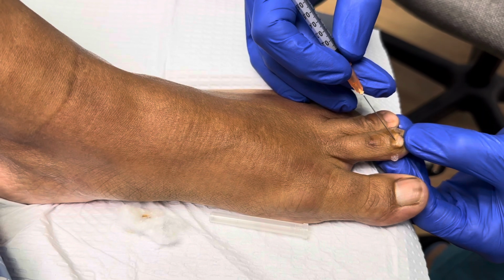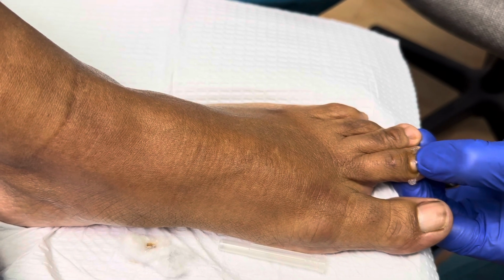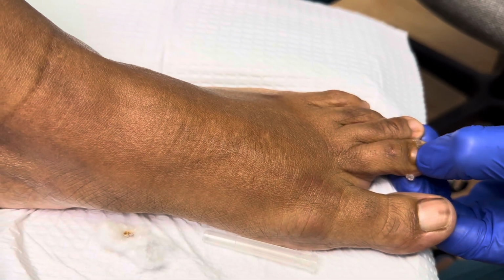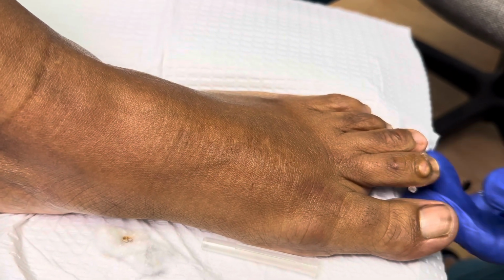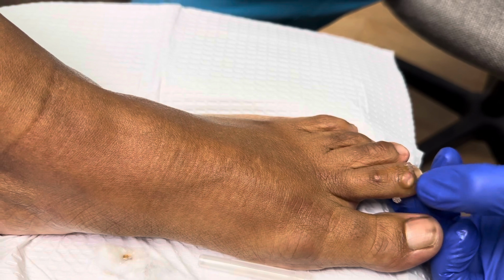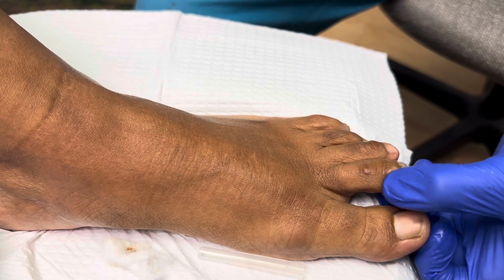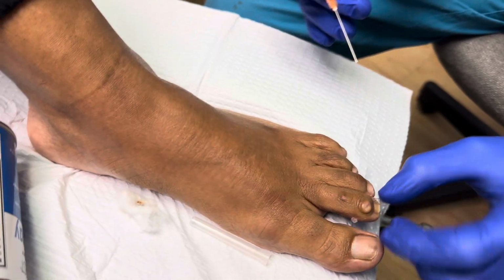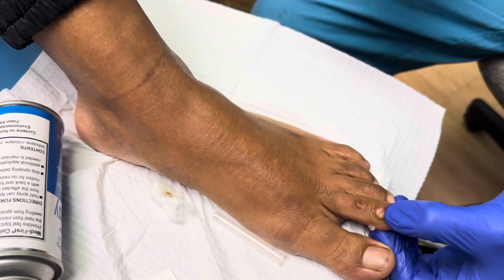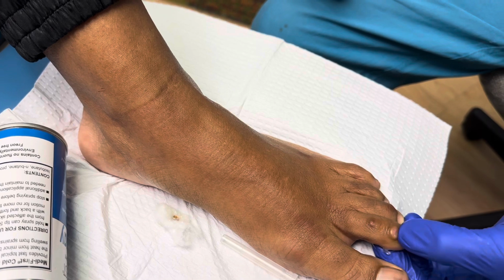We're going to score it again here at the base, and it's not hurting too much, but the pressure does hurt a little bit, and then again we can see the gelatin-like synovial fluid coming out. And we're going to keep doing that, and sometimes it'll take a minute to have the next little pocket of the synovial fluid drain. You do have to apply pressure, and then sometimes there's like little subcompartments of the cyst. So we're going to do one more on this side, and then this should be pretty much a done deal.